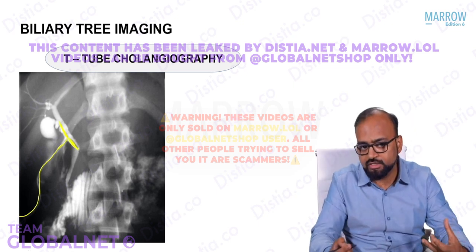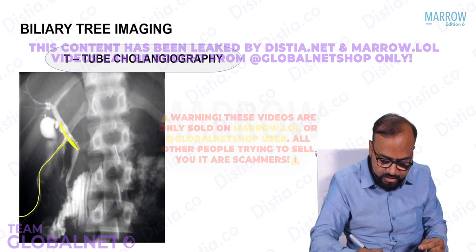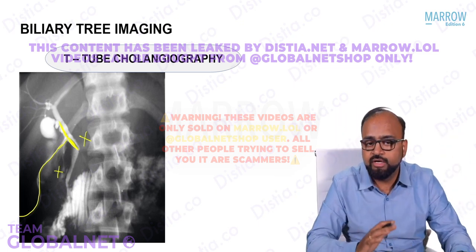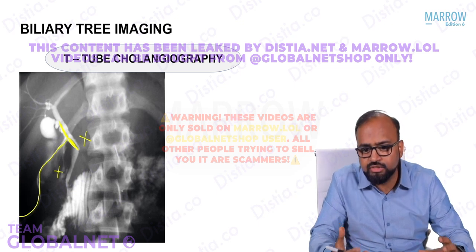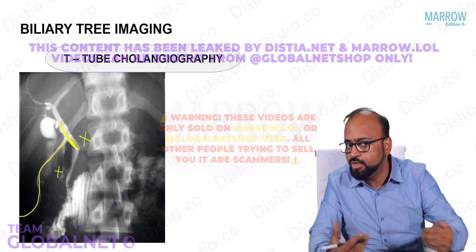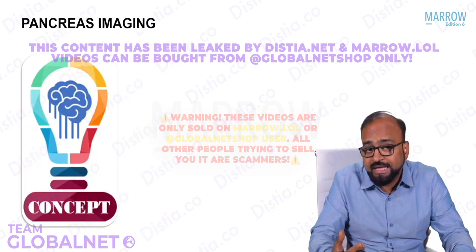A few days after surgery, before removing it, contrast is injected, the contrast goes into the biliary tree, and we rule out a leak of the contrast. If there is no leak, the T-tube can be removed. This is called T-tube cholangiography. It is usually done after insertion of the T-tube, inserted during cholecystectomy or after the biliary tree has been operated upon. Okay. Now come to pancreas imaging.